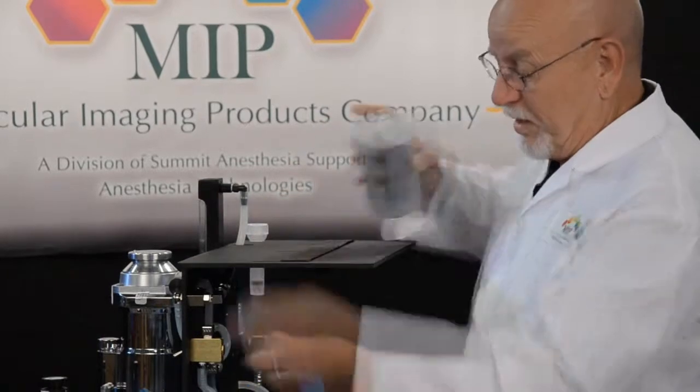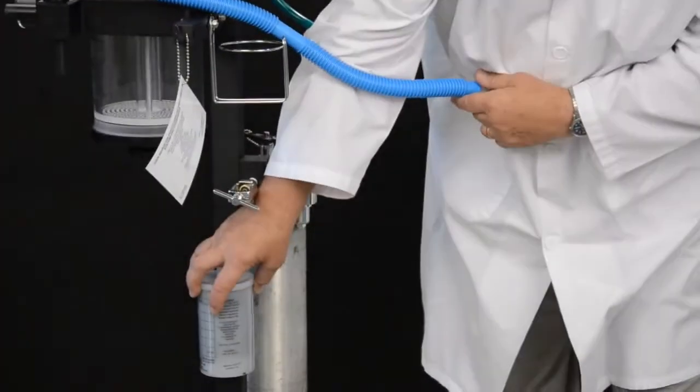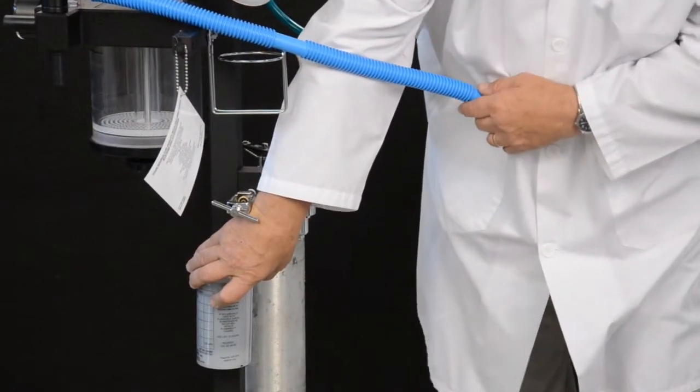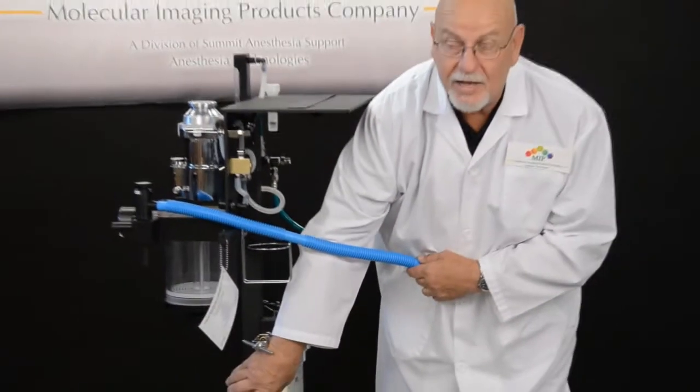What we really don't want to see is the activated charcoal filter taped to the post of the anesthesia device. The reason is, that discourages the weighing of the activated charcoal canister.